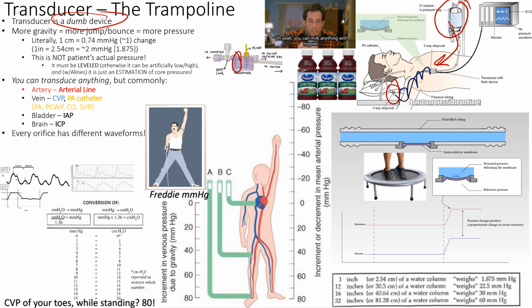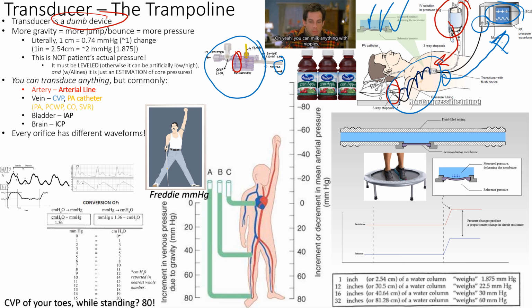The hard tubing, right? And then it's going to translate. It's going to literally bounce on this trampoline right here. It's bounce, bounce, bounce, right? That's what's happening with every pulsation that the patient is giving them, right? And that mechanical energy, or mechanical signal, is converted to electrical signal. So the gray wire we passed around then plugs into the monitor, right? It plugs in right here at the transducer, and there's a little cable right there, and it also plugs into the monitor. And that way we get the signal in the monitor, and then we, of course, interpret what that signal means.